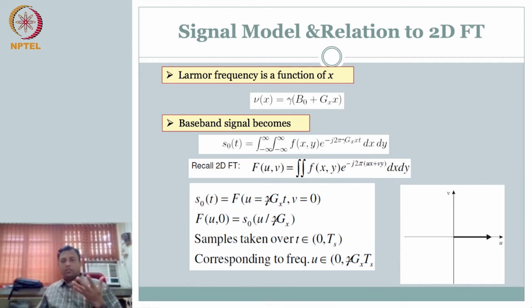Fantastic. So now it tells you that if I want to acquire the MRI signal, image MRI, then if I can repeat this experiment and cover the whole space, then I can take the inverse Fourier transform and I will have the object. And the object in this case will be proton density, where it is coming from, right? Clear? So fantastic. So let's see, if we have to do all this, we need to cover different strategies we can use.